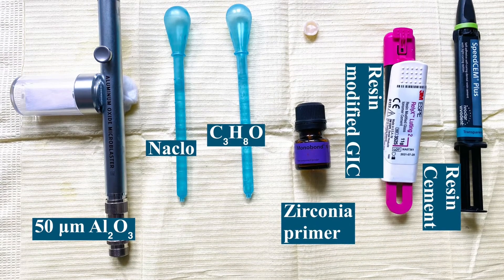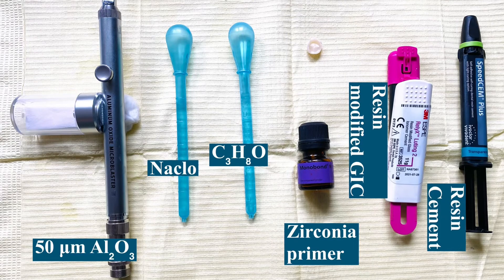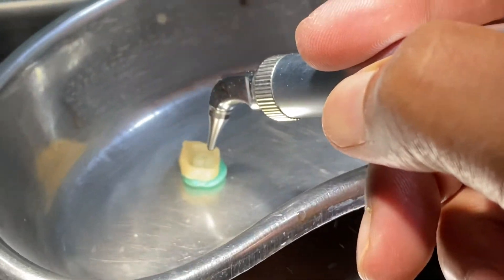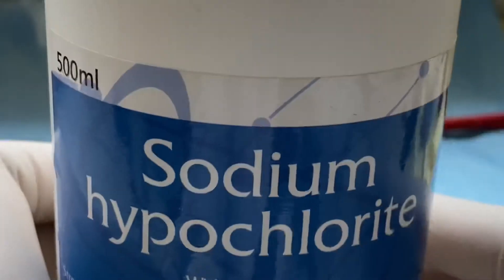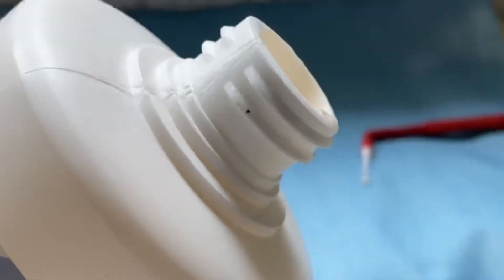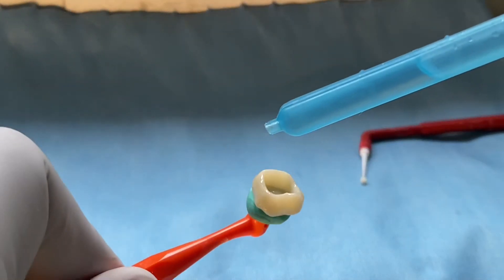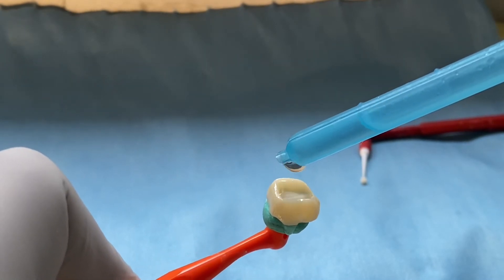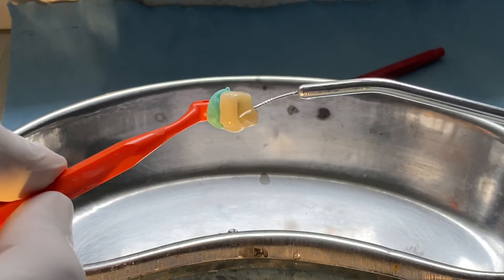Alternatively, sandblast with 50 microns of aluminium oxide, keeping at a distance of one centimeter from the crown with three bar pressure at a 45-degree angulation. Then clean the internal surface of the crown with sodium hypochlorite for 10 to 20 seconds, and rinse it properly with water.